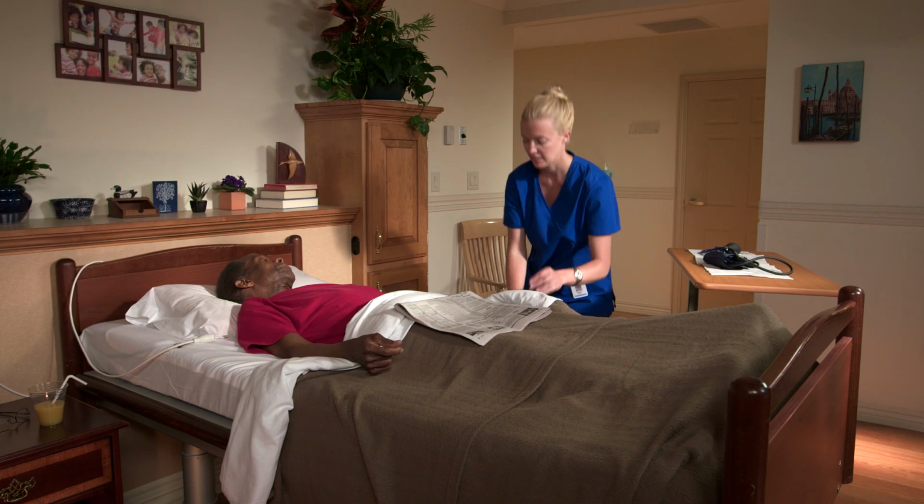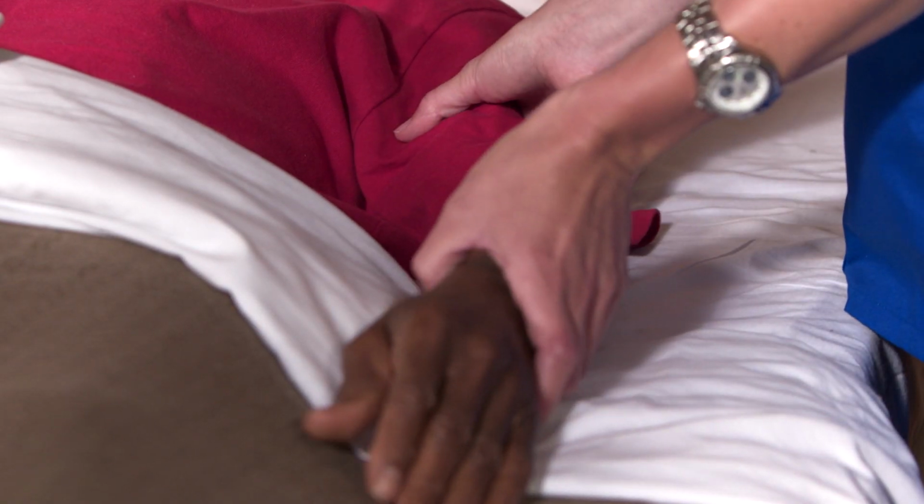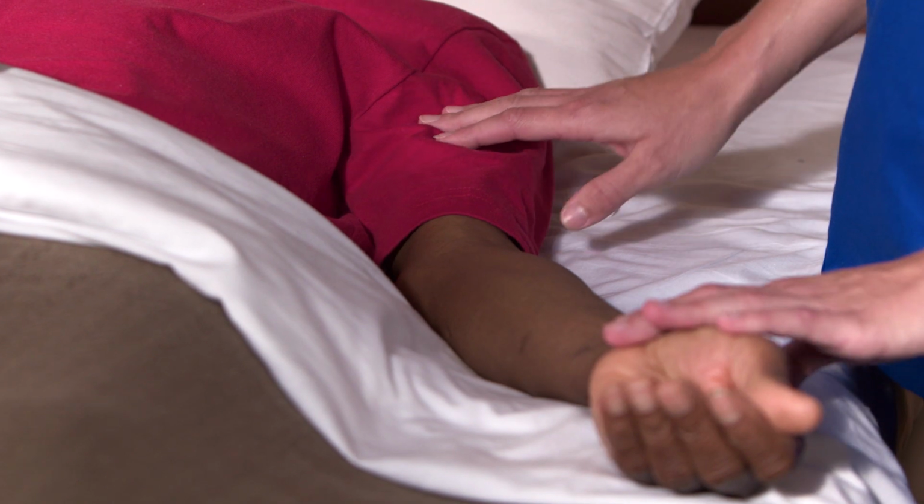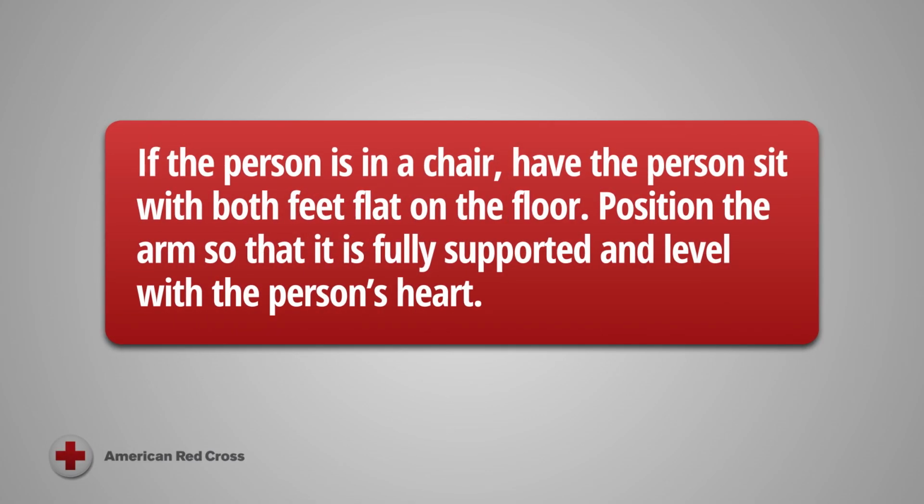If the person is in the supine position in bed, position the person's arm so that it is resting comfortably, palm up, on the bed. If the person is in a chair, have the person sit with both feet flat on the floor. Position the arm so that it is fully supported and level with the person's heart.